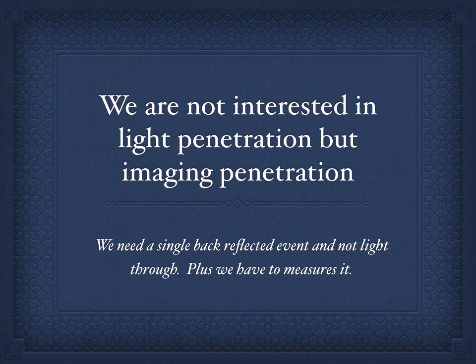A critical point: we're not talking about light penetration, we're talking about imaging penetration. Light penetrates easily millimeters in non-transparent tissue, but that light is reflected all over the place and bounced. We need to measure single scattering events. Light goes in, bounces, comes back. At either 800 nanometers, which is what's used in ophthalmology, or 1300 nanometers, which is used in non-transparent tissue, light penetrates many millimeters.